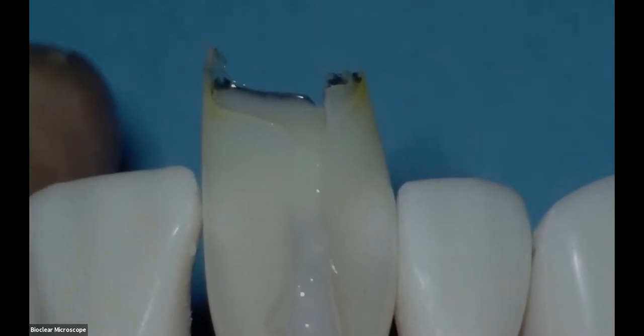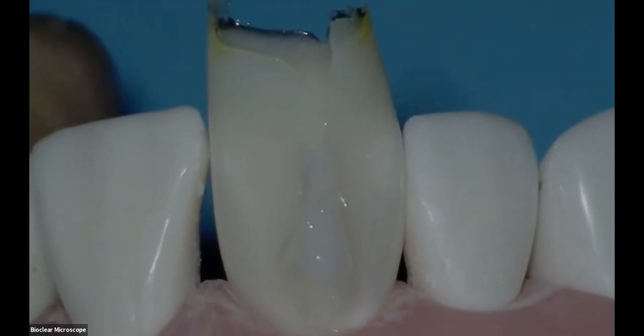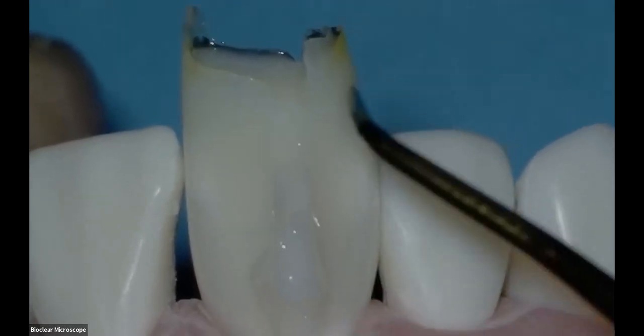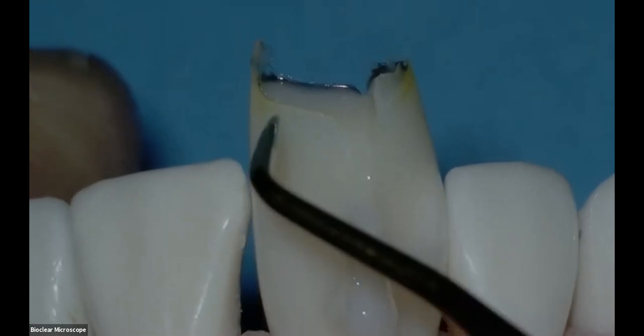Is it unpolymerized resin? No, that is polymerized resin. That is adhesive. And I haven't completely cured it up there. That adhesive started here and went all the way to the incisal edge. I want you to look at this beautiful, amazing, crazy emergence profile.